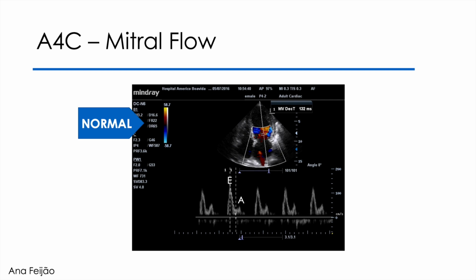Once the mitral valve is evaluated, I will evaluate the mitral diastolic flow. First, I keep the color Doppler window. To evaluate a specific zone, I call the Doppler, the PW cursor, and I set the sample to 1 to 3 millimeters and place it 1 millimeter from the tip of the open mitral valve leaflets, a little closer to the sidewall, bearing in mind that the flow is ejected in that direction.